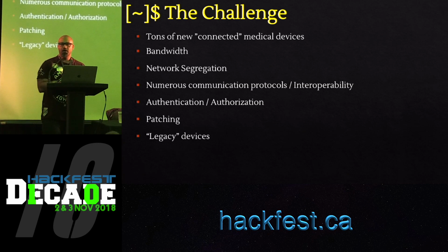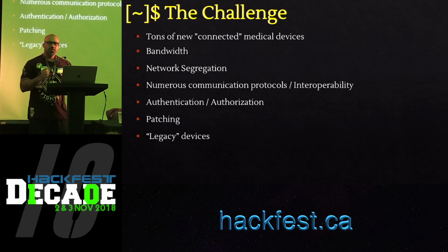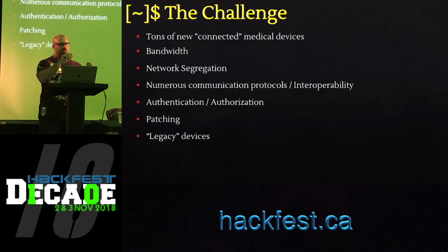I was talking to a couple of people who work in the medical industry, are responsible for managing these networks, and one of them mentioned that how they do it is they put all the medical devices in one VLAN, and then the hospital systems in another VLAN, which is cool, but still doesn't solve the problem, because if one medical device gets compromised, then it can be used to compromise all other medical devices, right? And probably there will be a jump box somewhere which will allow you to jump onto the other system network.